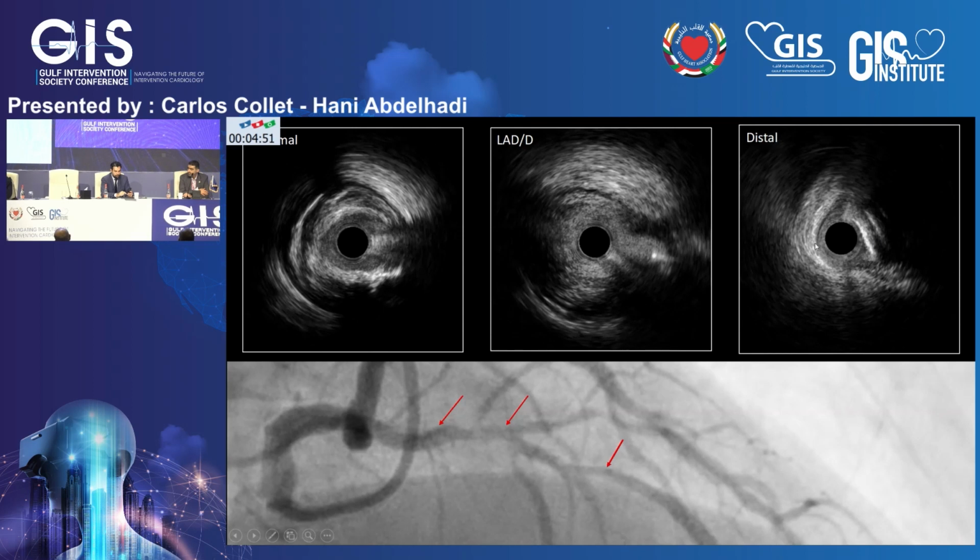At the distal vessel, this is obviously diseased and not a suitable landing zone. This is eccentric plaque, not a calcified nodule, as you can tell by its flat appearance, but also because of this gentle balloon dilation. What it's led to, like many eccentric plaques, is a dissection at the edges of the fibrous calcific interface. So now the calcium has been liberated and is pushing in on the lumen. At the tightest segment, at the site of the diagonal, you see a large plaque burden, which is consistent with the area of the necrotic core. That's also consistent with the highest atherosclerotic plaque and tightest lesion.